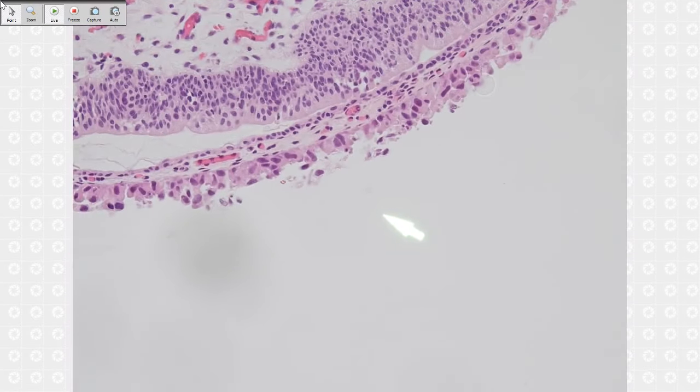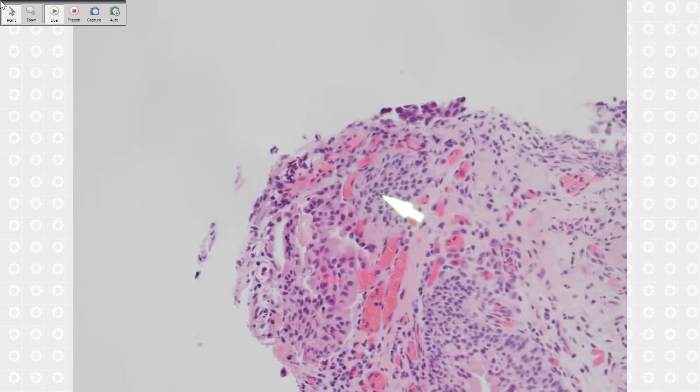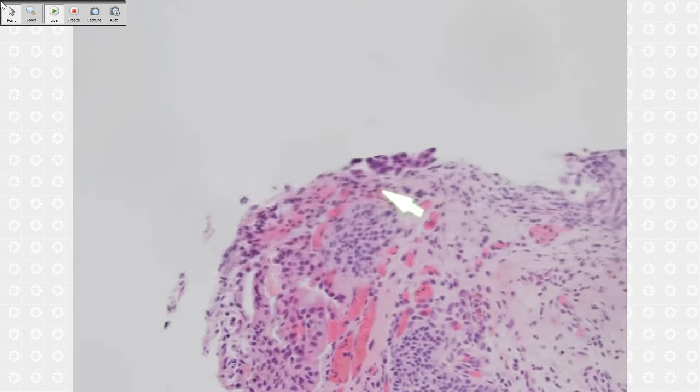Okay, see this area is folded, right? Folded from here, folded there. Just across, these cells are actually quite small. This may be another one, maybe denuded or something. You get the sense, right? When you call urothelial dysplasia, the cells are maybe 1 to 2 times larger than a lymphocyte, but this one is almost 3, 4, 5 times. Okay. The next one I show is a fine case.